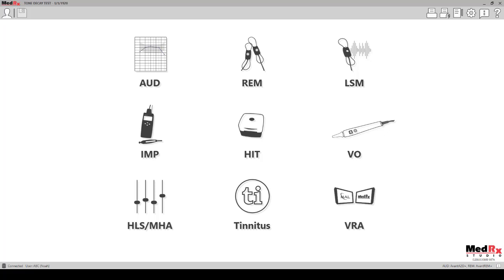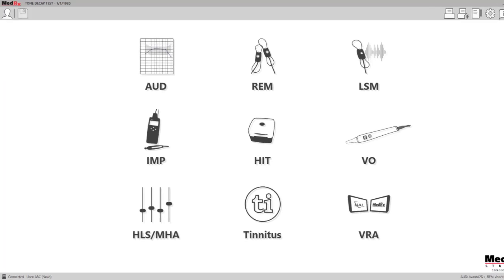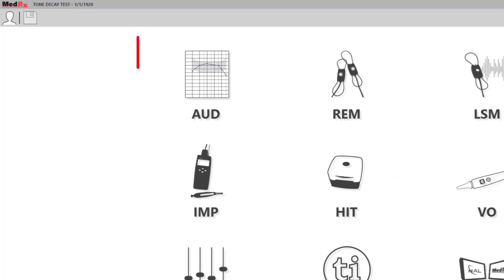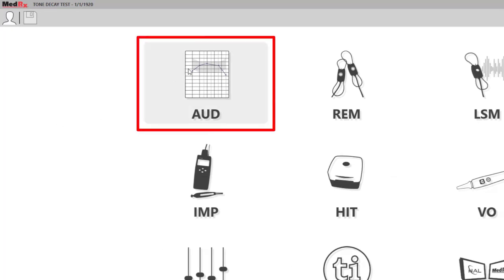This main screen of the software will have different modules displayed depending on which pieces of equipment you have from Medrex. In order to complete the tone decay test, you want to click on the audiometry module.